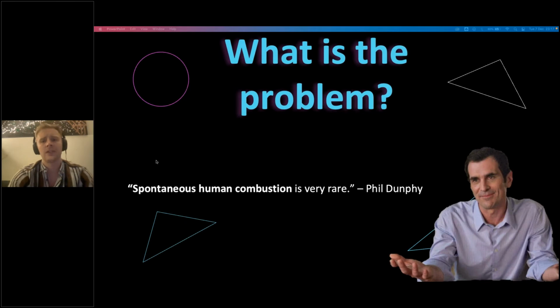We really want to make sure that the eyes are well lubricated before we start refracting, and that's one of the top tips I'm going to start with here: make sure the eyes are well lubricated. This will smooth out the refractive surface, covering in some of the lumps and bumps. It's a little bit like an uneven floor. If the floor is wet, it makes the floor that little bit more even and will help you get a better endpoint.